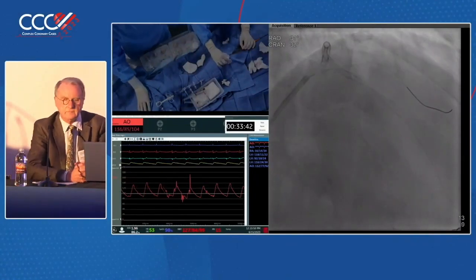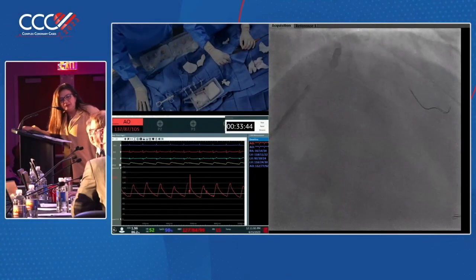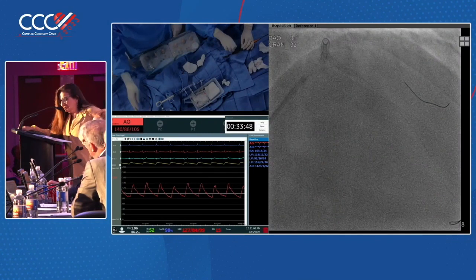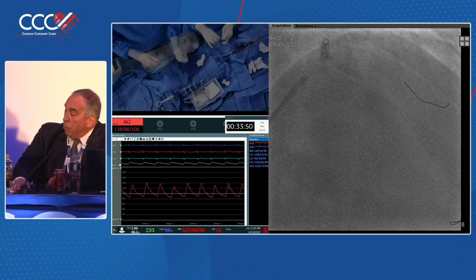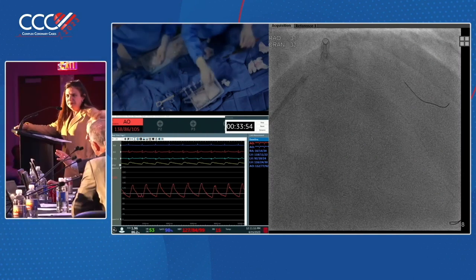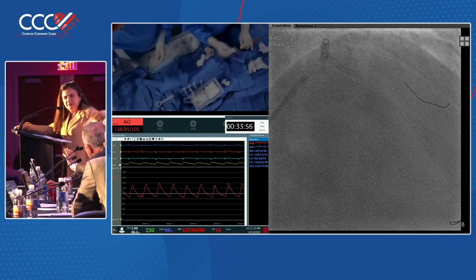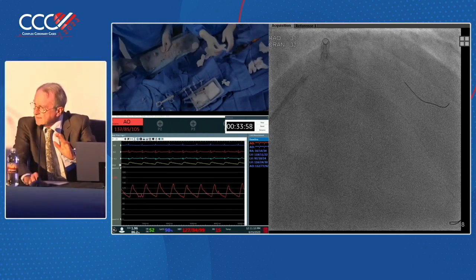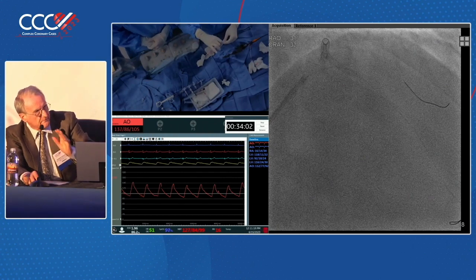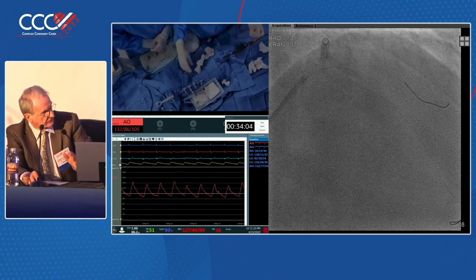Oh, interesting. So that could be sort of a futuristic approach for us in the US. What do you think, John? I agree. I mean, that's a great opportunity to employ that. Those are the devices we're anxious to get our hands on. We've almost abandoned direct 2-stent stenting; it means stenting with 2 stents. We only do it for major dissections.